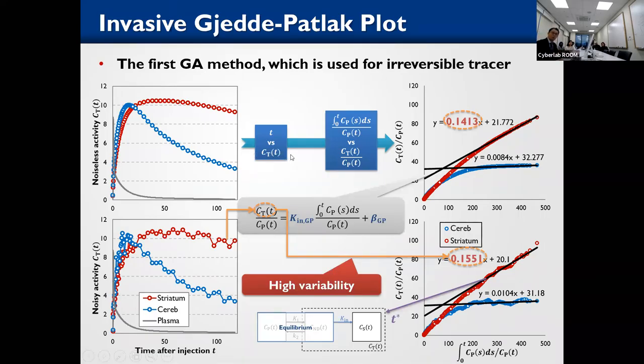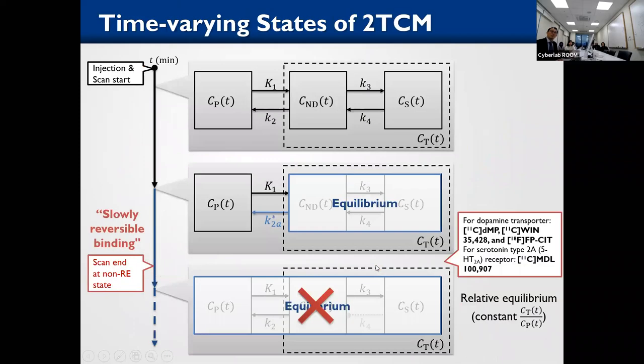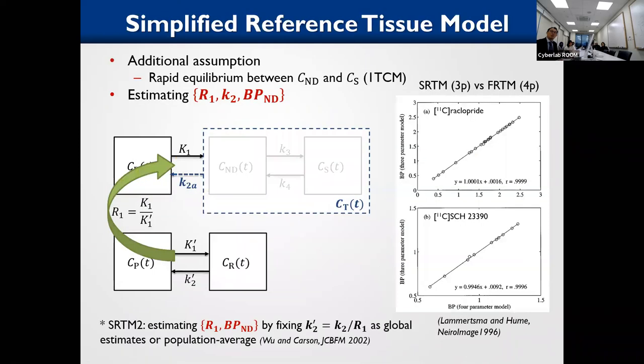This is what I have prepared. I think the last part, the graphical analysis or the example of the compartment model, is not easy to understand, but I want to emphasize that the concept is: we get the input data and tissue PET data, compare the generated one and the measured one, and find the best parameters to make the most similar case.